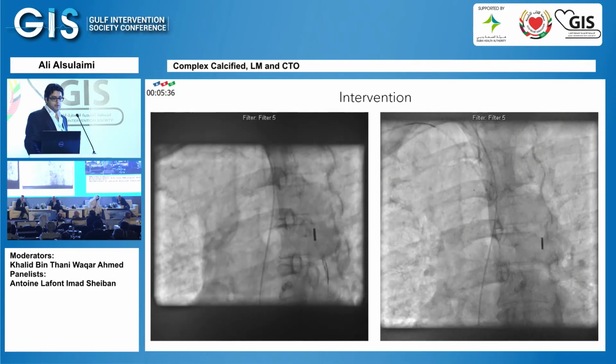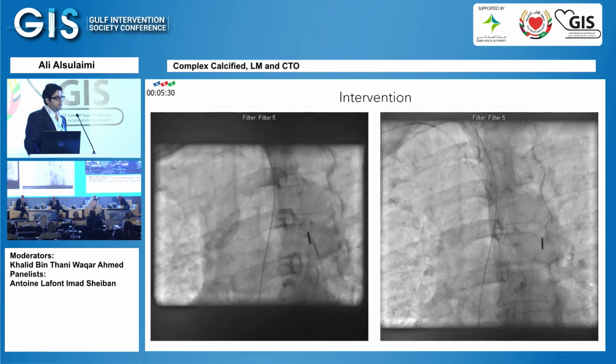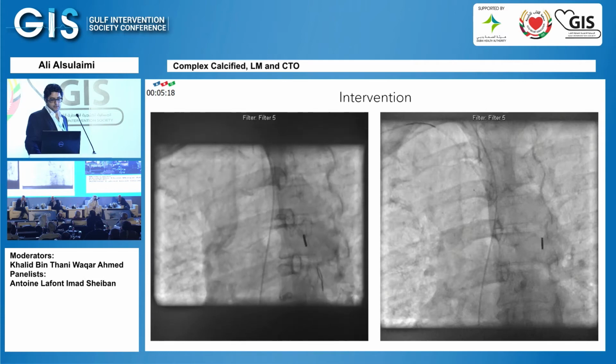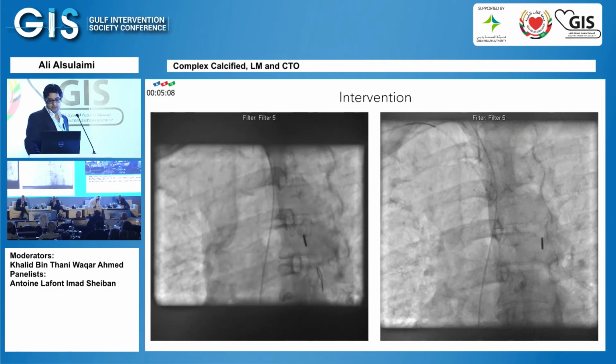So here you see the balloon pump and the aorta. This is when, after she arrested, we put CPR, we put a mechanical support with a balloon pump. At that point, she stabilized, and we were trying again to snare the wire. When we were snaring the wire, we catch it, we pull, but then we lose it. And you can see in the arch of aorta now, there's some fragments of wire hanging out, and we were trying to snare that.